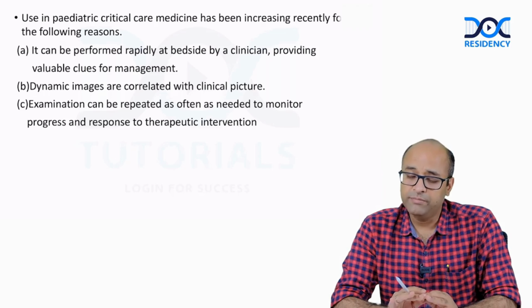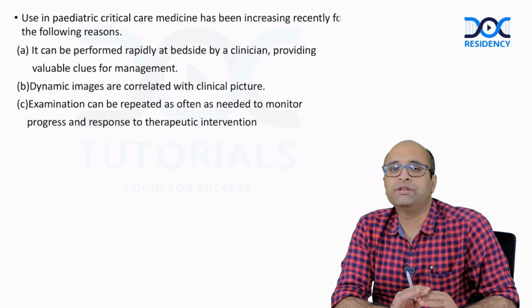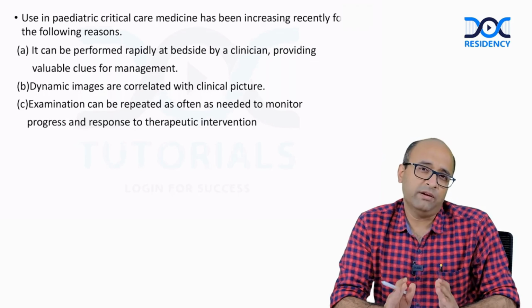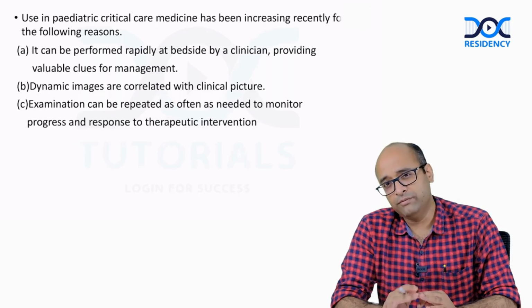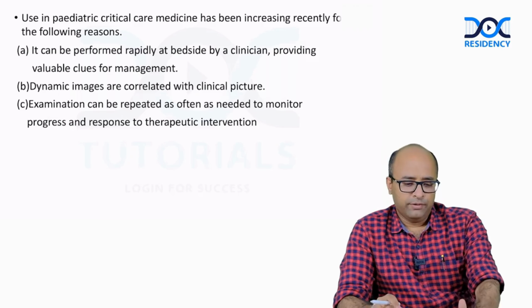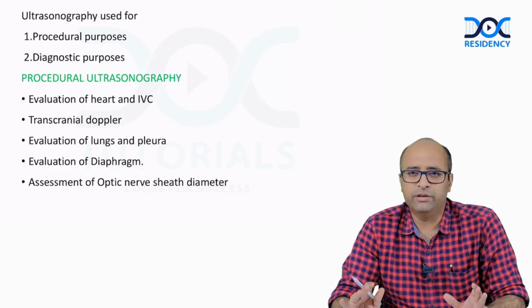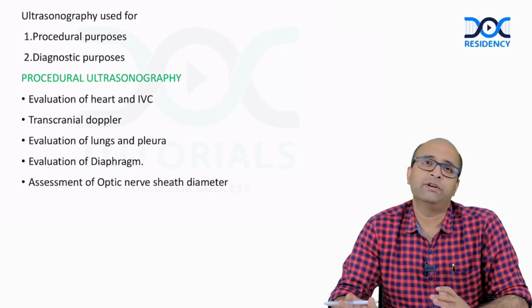These dynamic images which are generated by ultrasound help us in correlating with the clinical picture. Most often, if our examination findings are backed up by a real-time image of what is happening, it reinforces our thought process and reinforces our therapeutic intervention. When we deal with ultrasound, there are two important sets of conditions where we generally utilize it. First is for therapeutic or procedural, second is for diagnostic.